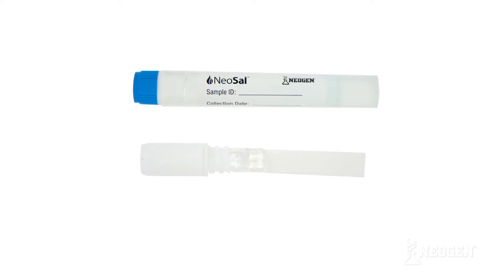The NeoSal includes two components: an oral fluid collection pad intended to collect the sample, and a buffer tube intended for stabilization and storage of the sample prior to laboratory testing. The unique features of both components will be explained in more detail in the following scenes.